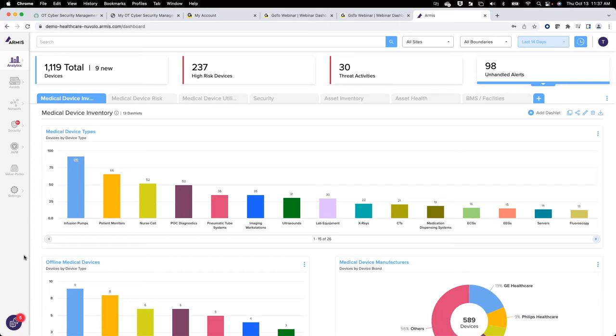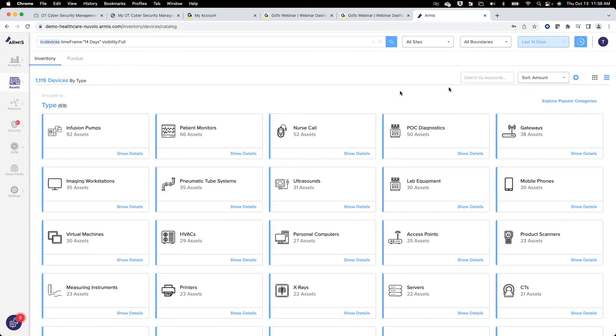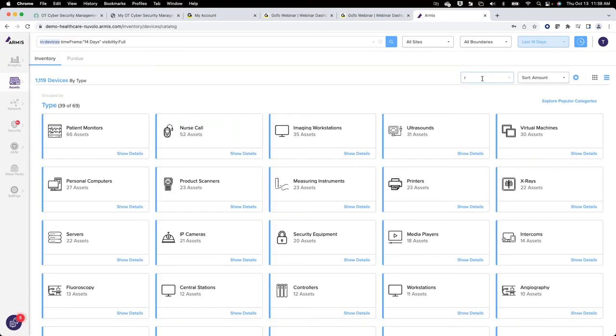Yeah, because we have permission for a vendor to do remote diagnostics. Sure. Mm-hmm. Come in and look at it. Yeah. And that'll be depending on breakage or. Sure, but you know who those vendors are and how the normal traffic works. So you would create an alert to reflect that. So if they do anything out of baseline that's anomalous, out of character for them.